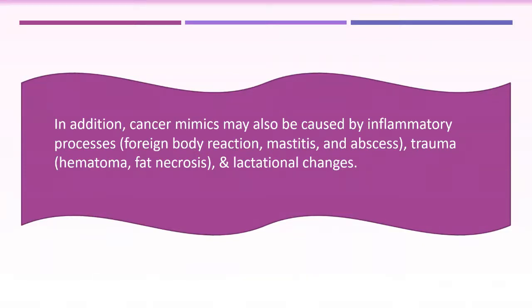Okay, mastitis, trauma including hematoma, fat necrosis, and lactational changes. And we said usually fat necrosis follows trauma, either direct trauma or surgery. Okay, and these other entities are included in the inflammatory process. Okay, can you tell me about these lesions?